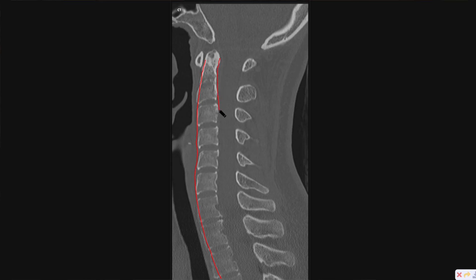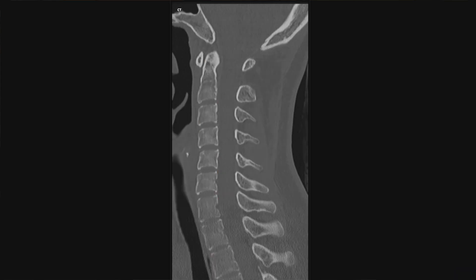Then there's the posterior vertebral line that runs along the posterior aspect of the vertebral bodies, and as with the anterior line, I just want to make sure that the vertebral bodies look properly aligned. I then look posteriorly at the spinous processes. I want to make sure there's not any widening or what we call splaying of the spinous processes, which can indicate something called a distraction injury. These are typically either hyperflexion or hyperextension injuries, and these can be very devastating.